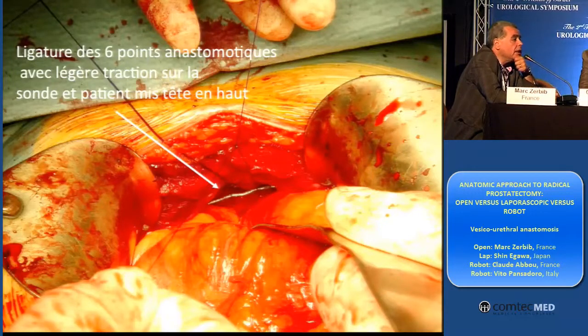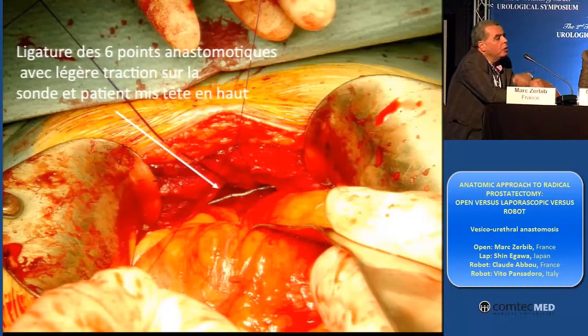This is my anastomosis. It's my manner to do using a double needle PDS 3.0. And I am sure that at the beginning of the procedure I have my urethra, so I don't have to look for it at the end of the procedure, which would take more time.